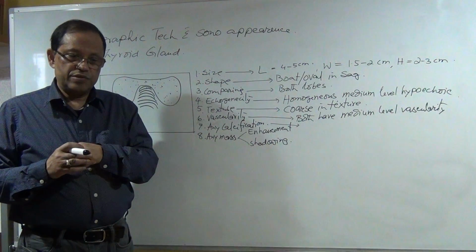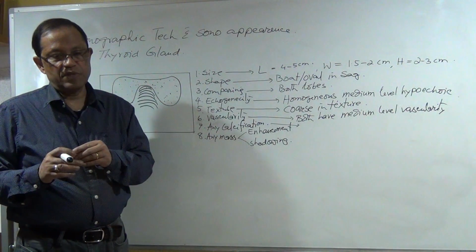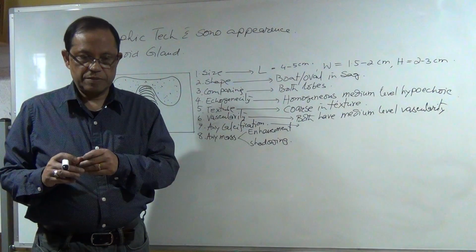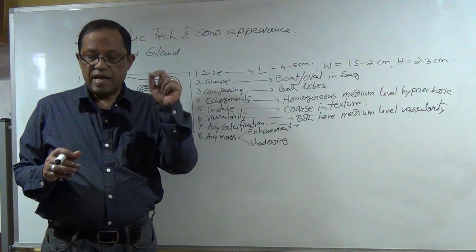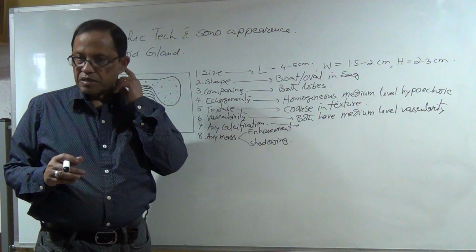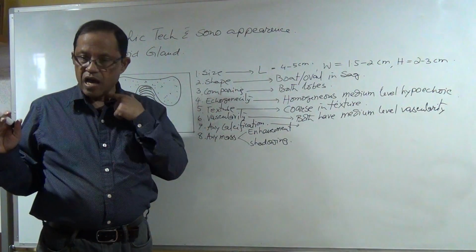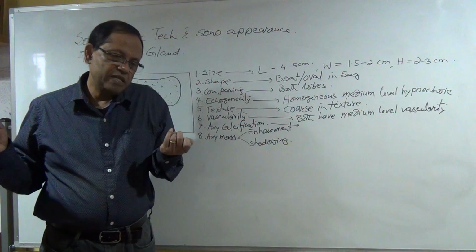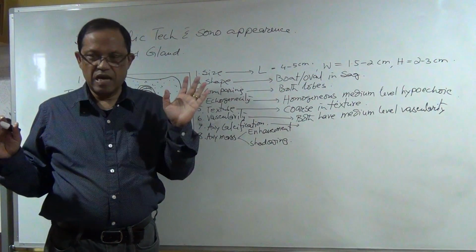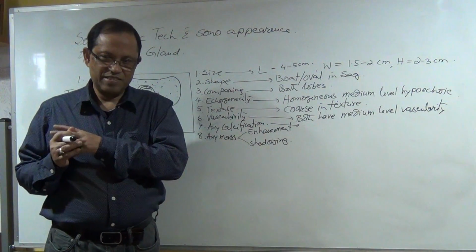Shadowing not always. I saw a lot of cases where there is no shadow, but there is a deposition of the calcium, calcifications. Then what does it mean if you see the calcifications? In certain organs calcification is precancerous, but in certain organs calcifications are not cancerous, like thyroid gland. I saw thyroid gland calcifications. Then I saw in the uterus calcifications, but they are not precancer. But in the breast, microcalcifications is very important.